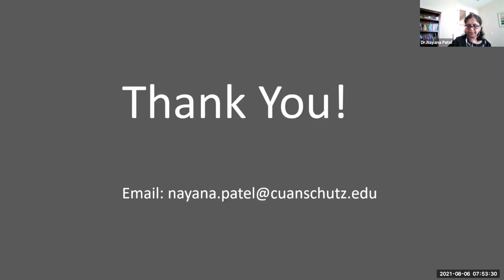Another important thing to remember, based on the literature, is that PI-RADS scoring does not have high inter-reader agreement. So there is a lot of variability in the way people report, even using the PI-RADS documents, because it is not an easy exam to read. It requires experience. There is a learning curve.